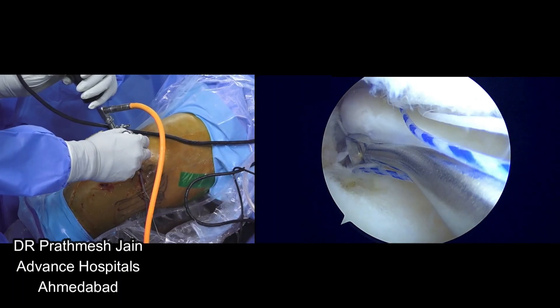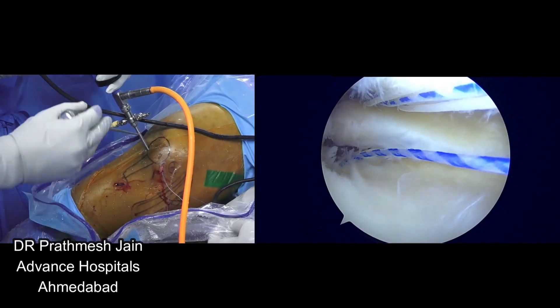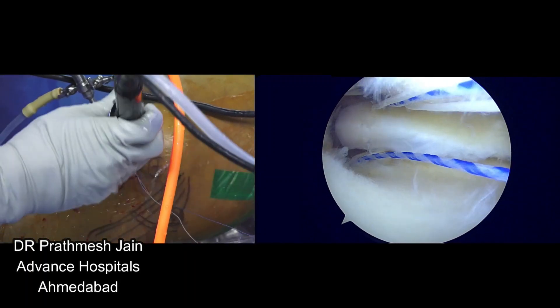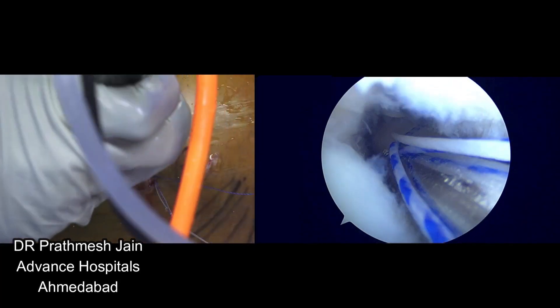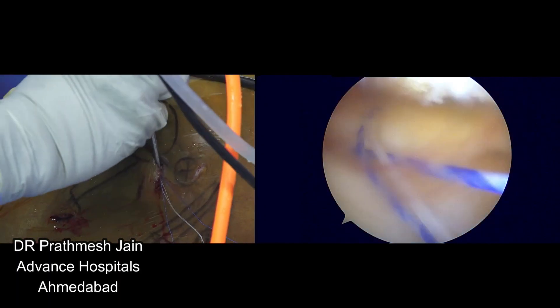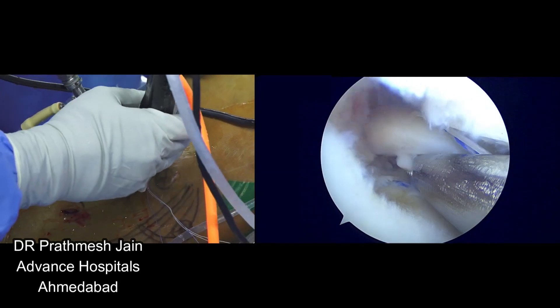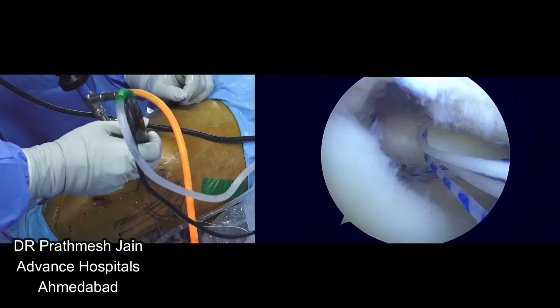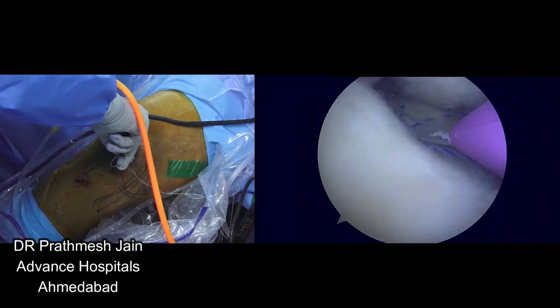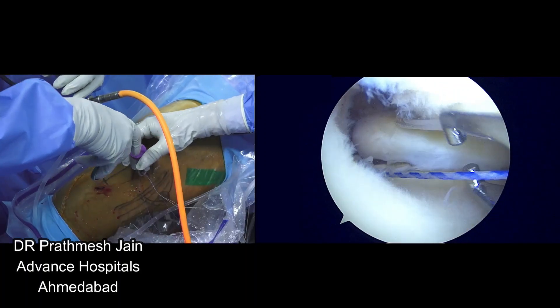What I am doing right now is preparing the area in the vicinity of the anchor insertion for healing, so that the meniscus root heals well — there is direct contact of bone at the area of the anchor and indirect contact nearby, which will lead to good healing. Suction please. Now I can just use the suction to suck away the parts of the cartilage which we have curetted out. We'll remove the harvested cartilage parts and we are all set to tie our final suture limbs in a particular sequence.